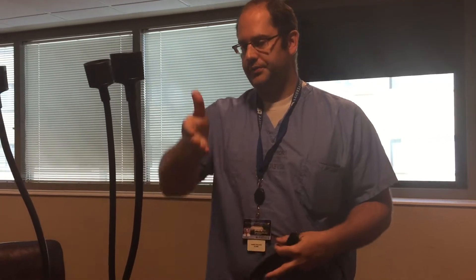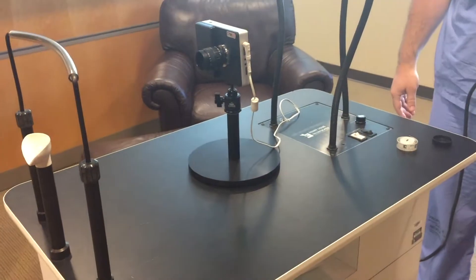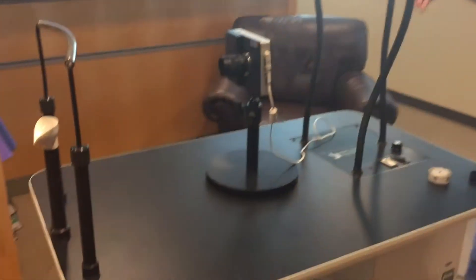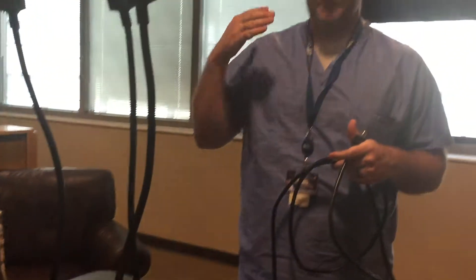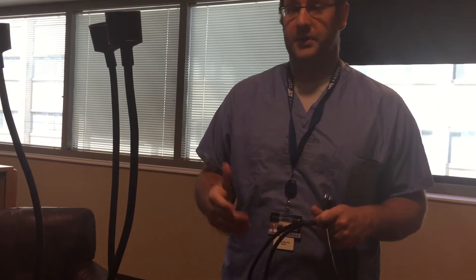This is just to show our technique on how we film patients for our Blink study. This is our pupilometry table that we have converted into our Blink study, and we've modified it a little bit, but really I'm just showing you this to show all the steps from beginning to end on how to start to record a patient.